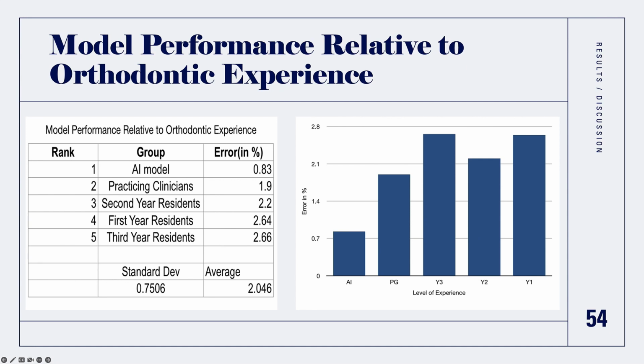Finally, our program would likely be of significant use in research settings where lateral cephalograms are a key tool in longitudinal outcome-related research. If this program could suggest landmark locations that outperform the average clinician, it could likely act as a tool to standardize and speed up the data acquisition process.